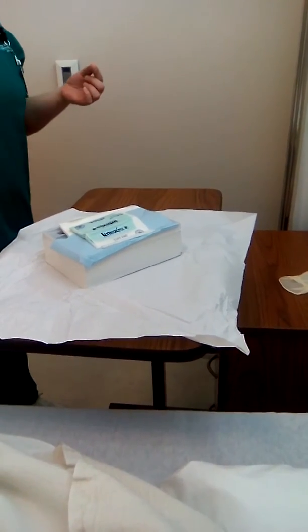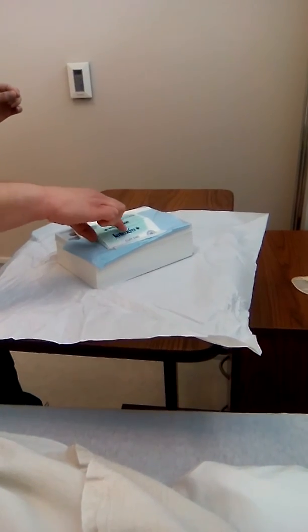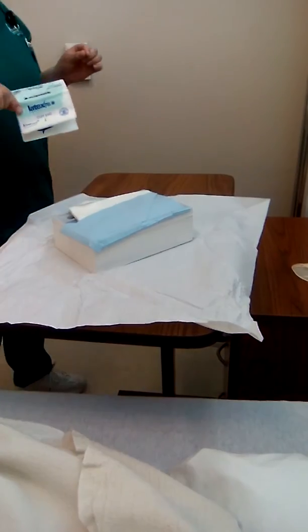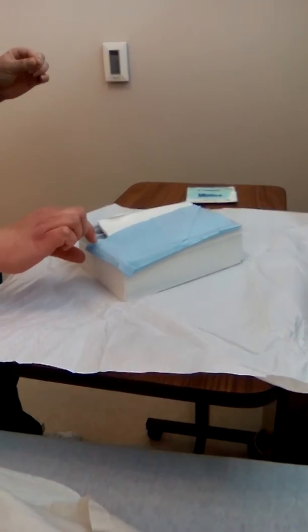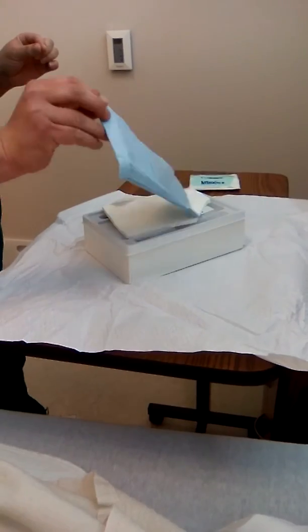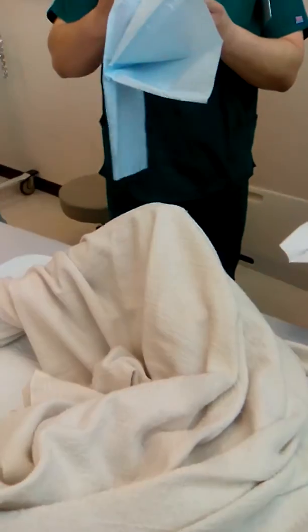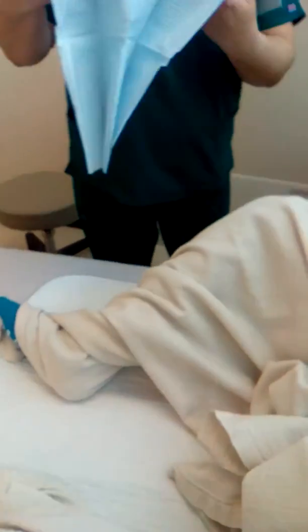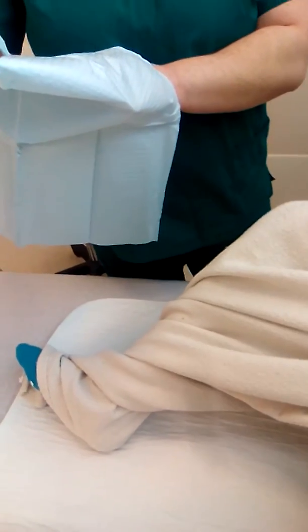I am going to remove my sterile gloves. I am going to remove the fenestrated drape. I am going to have my assistant lift the blanket on the perineum. And then I'm going to go ahead and apply gloves. There is a pad already here, so I'm going to go ahead and put it underneath them.